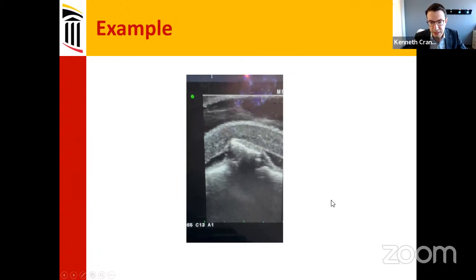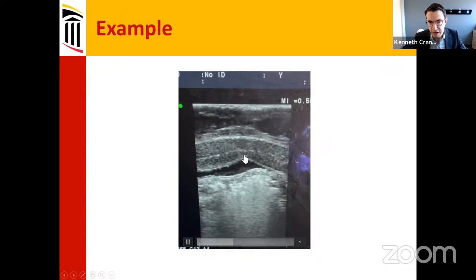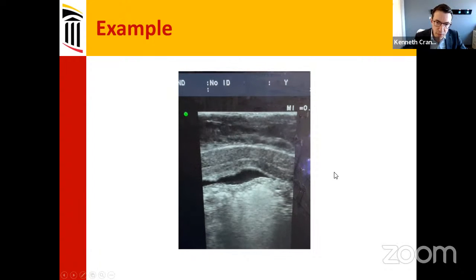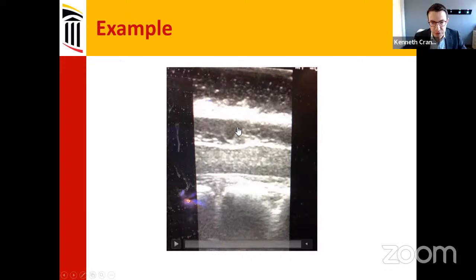And then this next image here, this is another video showing after we removed that big bony fragment, you can see that there's now CSF in front of the spinal cord. And if you look at the ultrasound video at that point, you can see how the spinal cord is pulsating. And then this is just another case, one last case before we get to the papers.